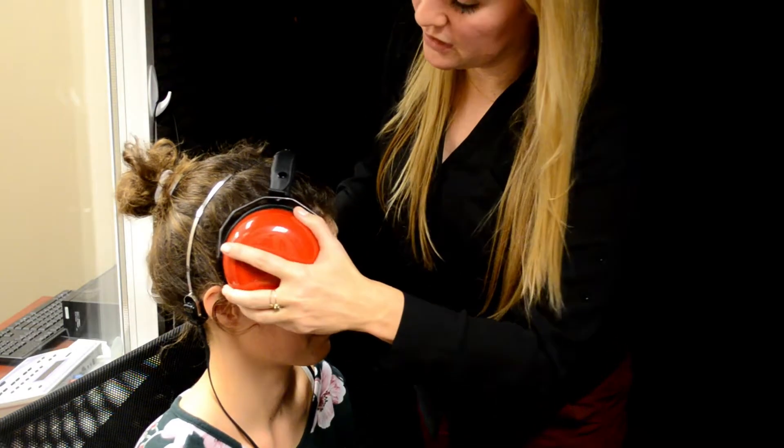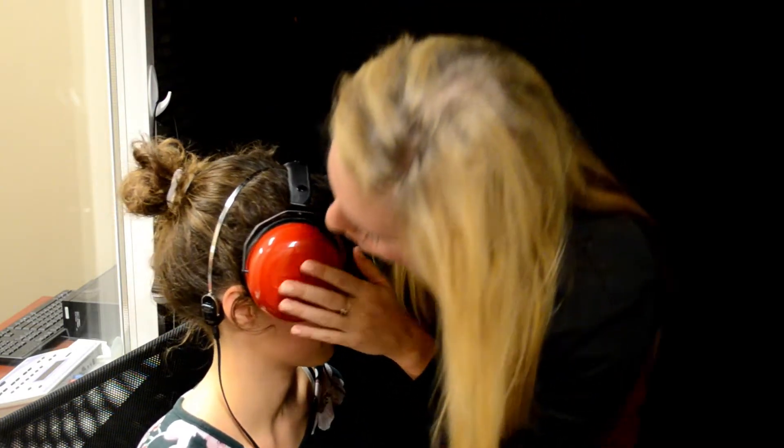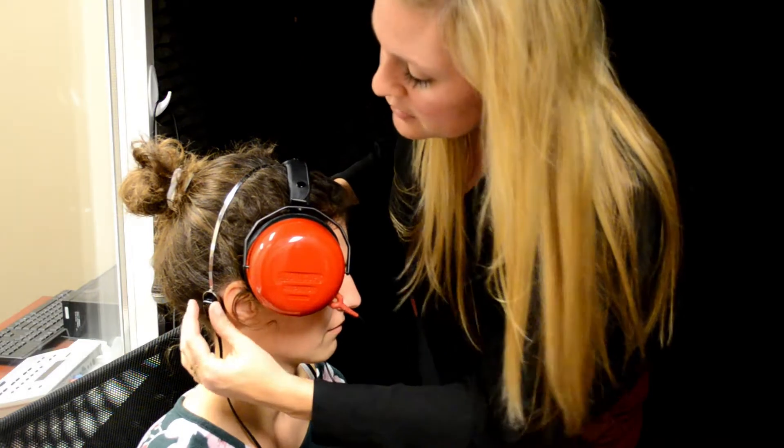We want to make sure it's staying in place. Everything looks good — it's still not touching the ear, so she's all ready to go.